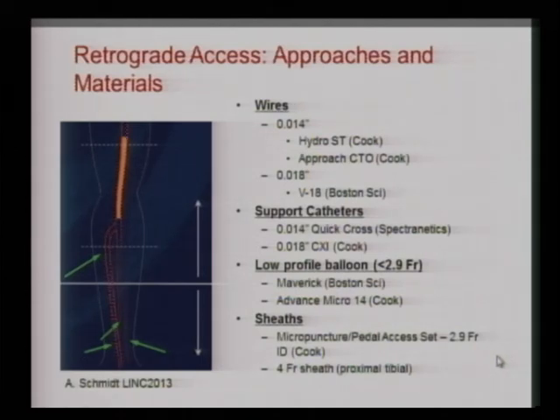There are a variety of different retrograde approaches that can be utilized with different target vessels and with different materials. In some ways, this is related to the angiosome or the area that you're trying to revascularize.